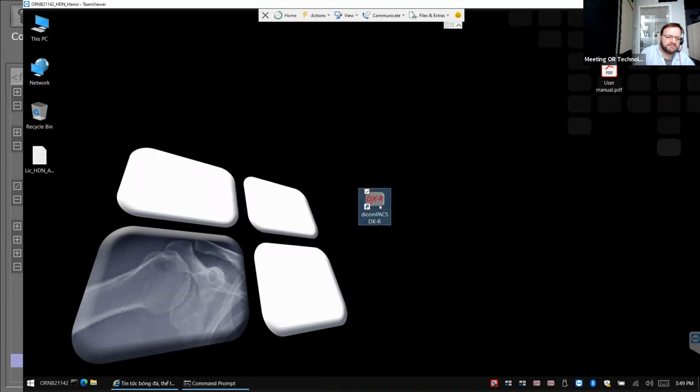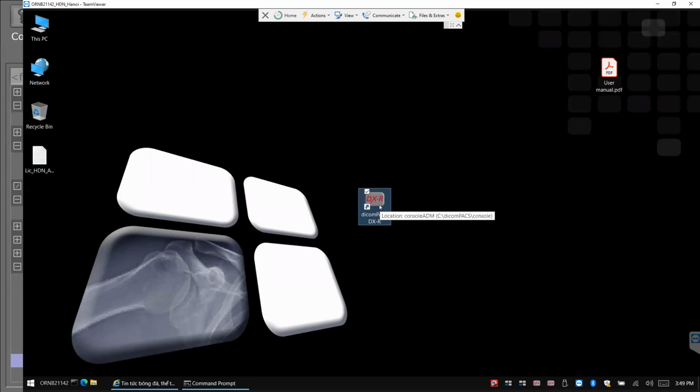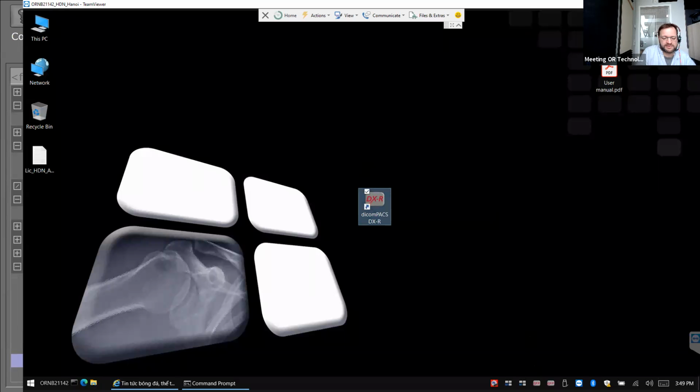So there is normally no way to check it manually if everything is working. It's vice versa. We are checking with the startup of the software if everything is working fine. And if the software detects something is not working fine, it will give you an error message.